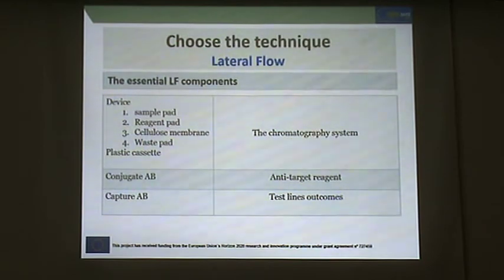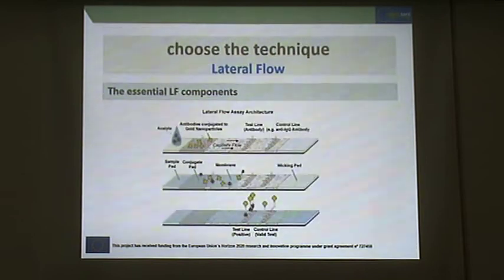The components of the lateral flow are basically a device, the plastic cassette which contains the device, and then we have the reagents. Here, you can find on Wikipedia how it is constructed, the components.